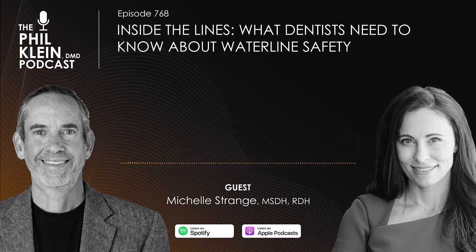So anything connected to that water bottle, any dental tool or device or whatever, you want to make sure that when you're doing the shock, you're running those systems, those devices, that equipment until you see that orange coming out of it, right? As soon as you see that orange coming out, then you know it's in that line of that device, and that's when you stop. And then it's the time factor that's helping you decontaminate and destroy as much biofilm that may exist there as possible. Exactly.